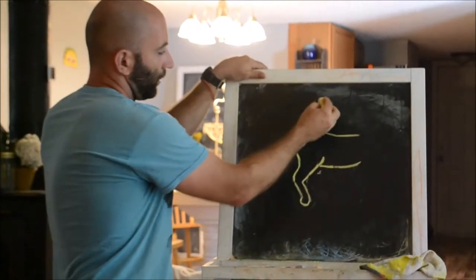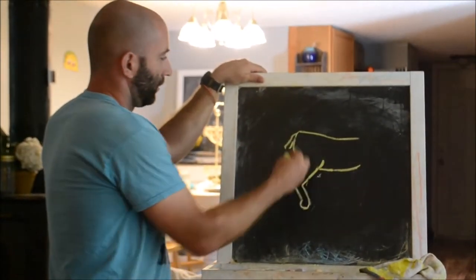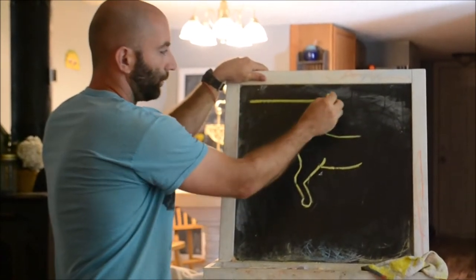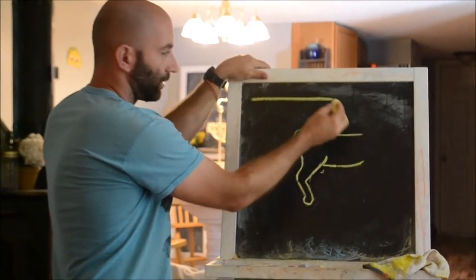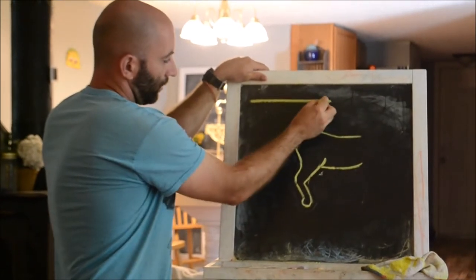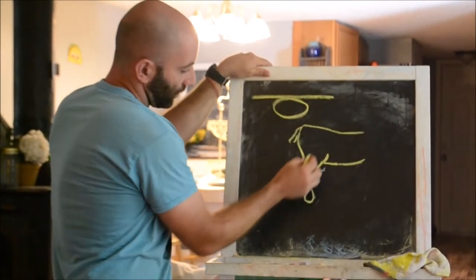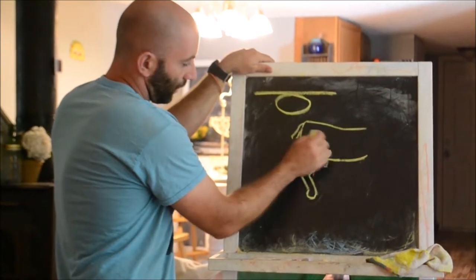This is the Schroeder-Thomas split. Basically you take a metal, like an aluminum rod, maybe like half inch thick, and you're going to bend it so that it's got a loop in the middle. You're going to slot that over the hip of the animal.